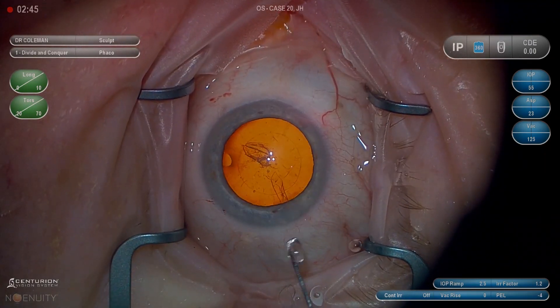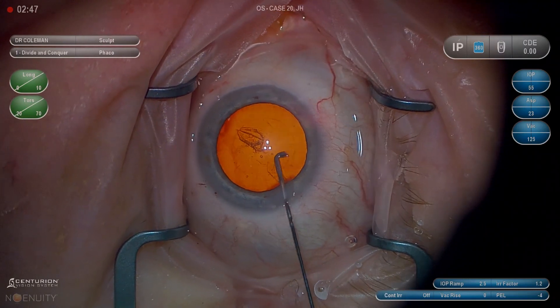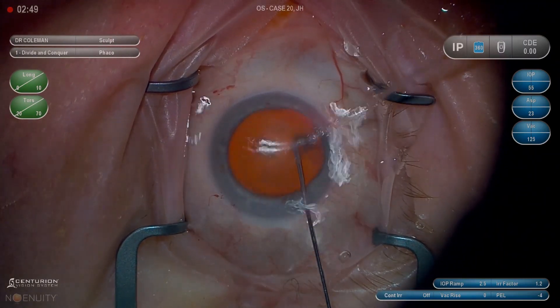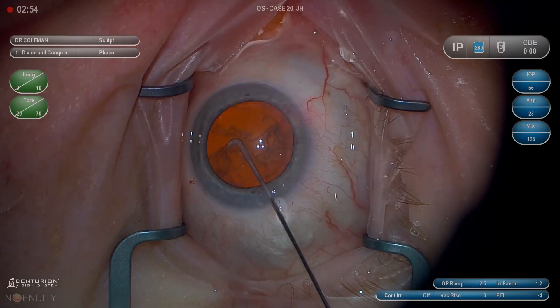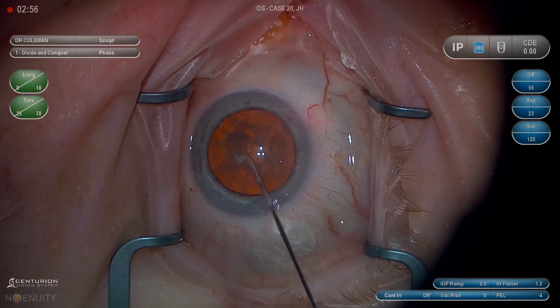Remember, hydrodissection is not a great idea if you have a white cataract — you can blow out the posterior capsule. That's a whole different section and I'll try to post a video on that later. If you're using a straight cannula, it works just the same and you can go in a couple of different spots.